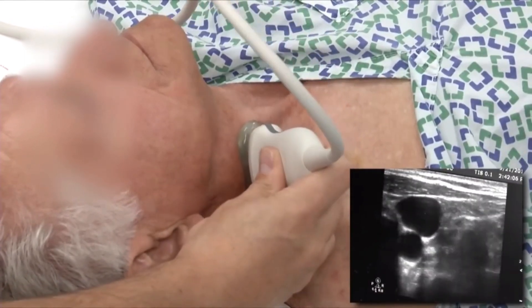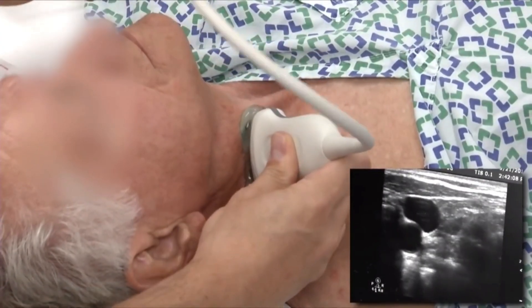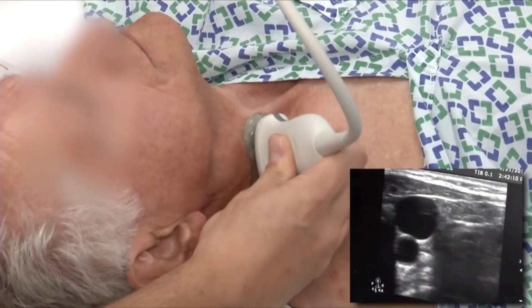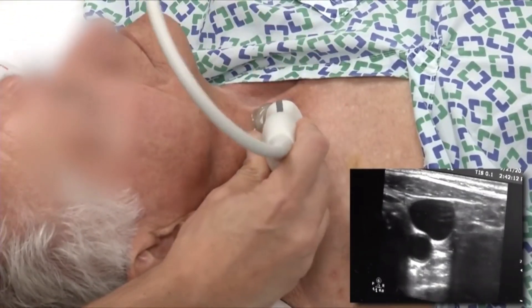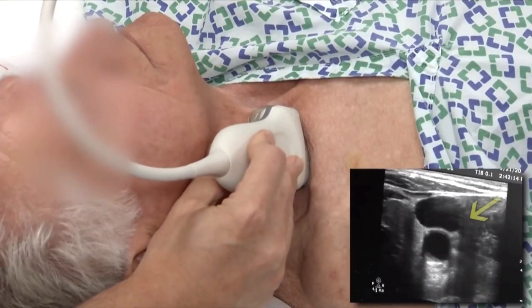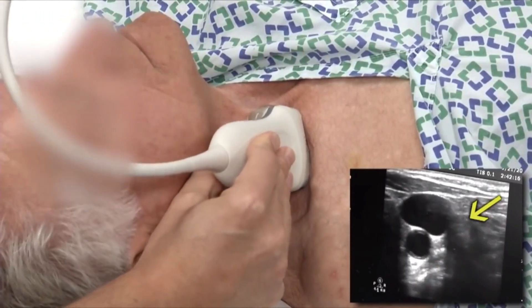Post-surgery monitoring of people who've had open heart surgery, valvular heart disease, such as leaky heart valves, cardiomyopathy, and pulmonary arterial hypertension.